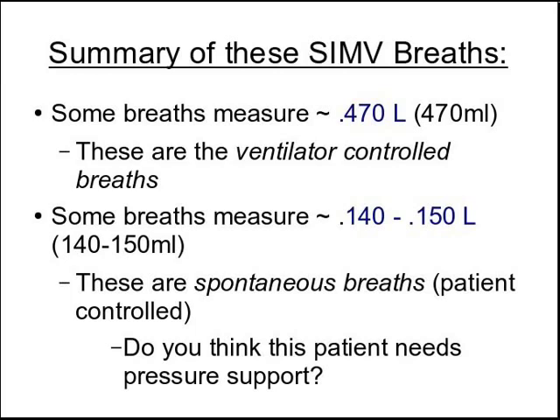This slide is a summary of what you're seeing here. As you can see, some breaths are around 470, and those are the assist breaths, the ventilator controlled breaths, where the ventilator is attempting to deliver 500. And then you'll see some breaths come back at 140 or 150 ml. These are the spontaneous breaths that the patient is taking. My question is, do you think pressure support might help?